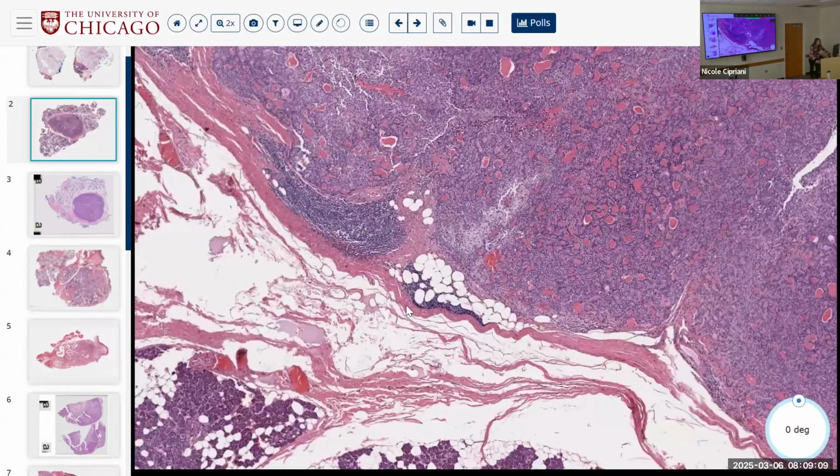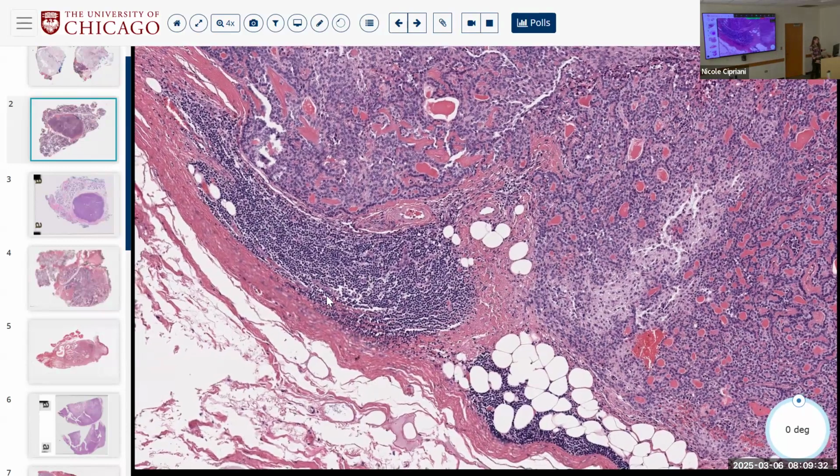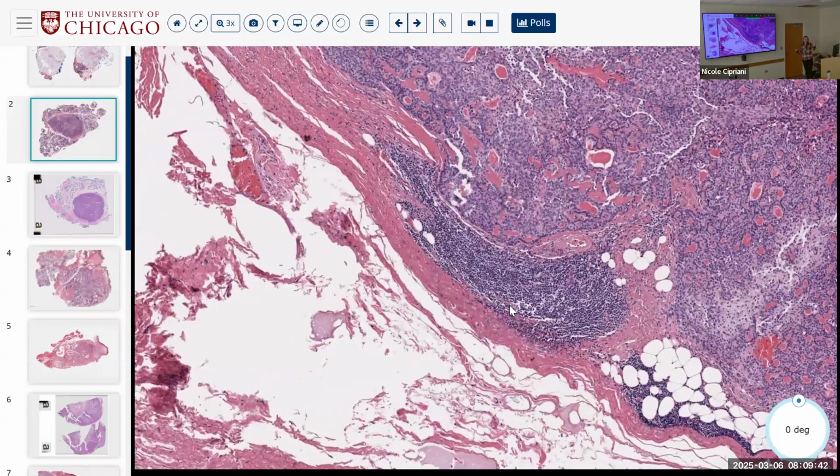Yes. So remember that you can have three types of things happening in salivary gland. You can have just tumor-associated lymphoid proliferation, which is not a lymph node, but just happens to be lymphoid stroma next to the tumor, just at random. And if you don't see a capsule, and if you don't see good sinus histiocytes, one could argue that this might not even be a lymph node, right? I don't see sinus histiocytes, I just see lymphocytes. So probably just tumor-associated lymphoid proliferation, may be related to the intrinsic nature of the tumor, may be related to biopsy.